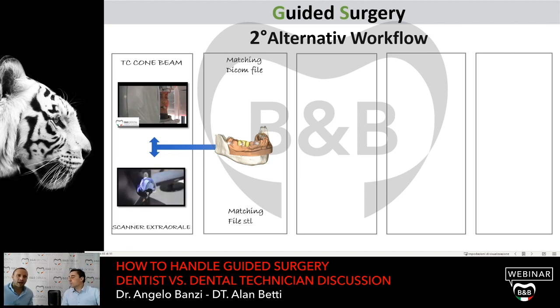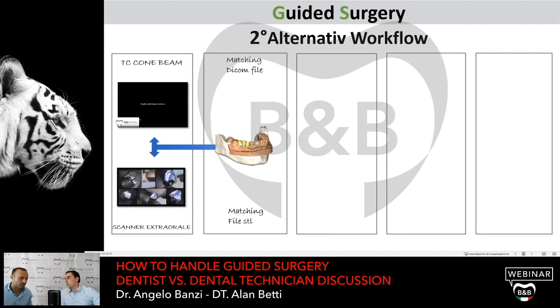In case of full arch rehabilitation, remember always to check the resin that I'm going to use to rebase the prosthesis, the radiological template, because it can contain metal. Why metal? Because it has been checked for an alternative method. The metal in the mouth of the patient can create a scattering effect, and if I understood well, also teeth can create a little bit of a scattering effect.